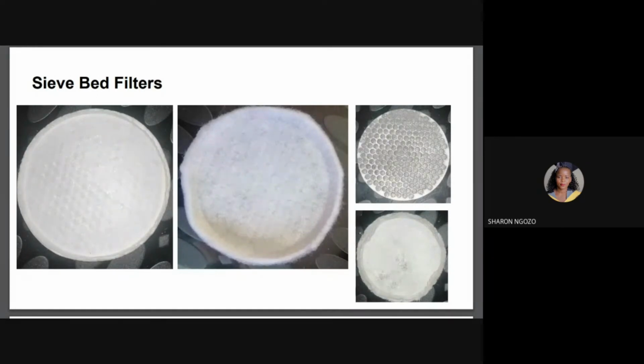In some cases where water has leached into the sieve beds, the filters will come in contact with water, which can end up damaging them. So when you're refilling this type of beds, you need to replace them with new ones. It is really necessary. If you can clean them, then clean them, and when they're completely dry, you can put them back in the sieve bed.